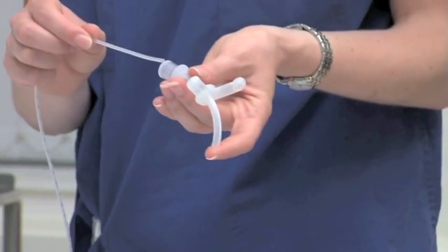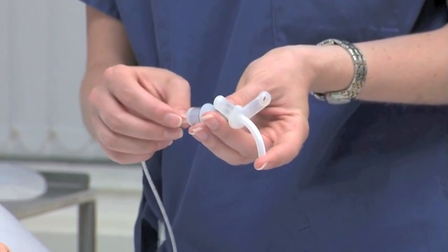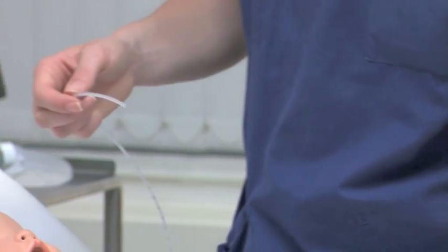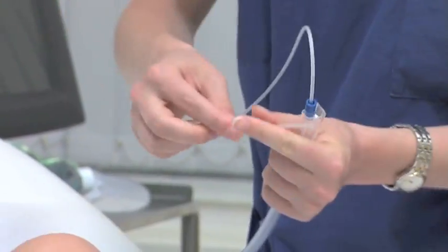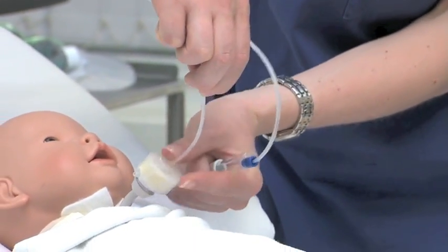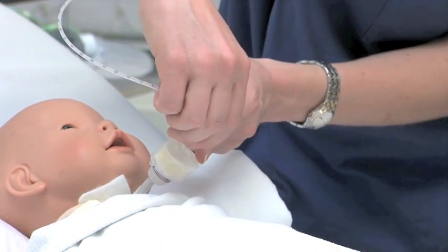To measure how far the catheter should be inserted, put the suction catheter into a same sized tracheostomy tube. The suction catheters have measurements marked on them in centimetres. It is important to measure because suctioning should only be performed just inside the tracheostomy tube unless it is absolutely vital to suction further. If the suction catheter is too long, there is a risk of damage to the child's airways.